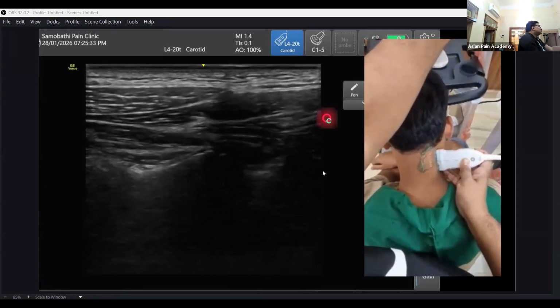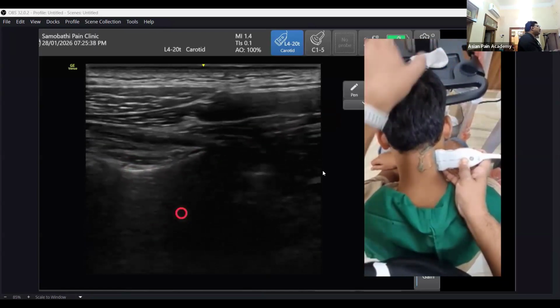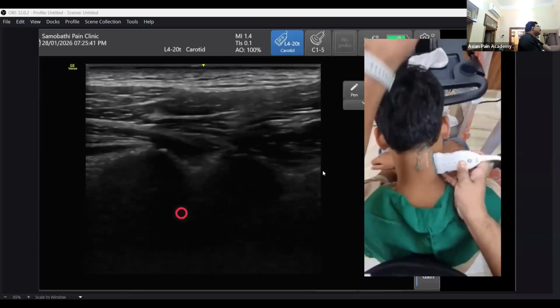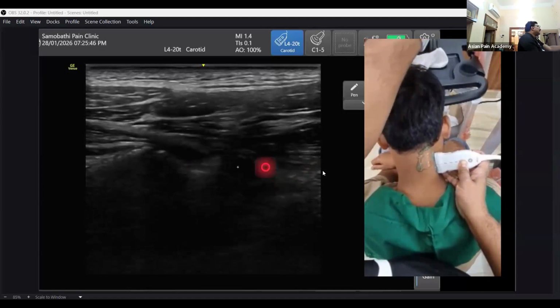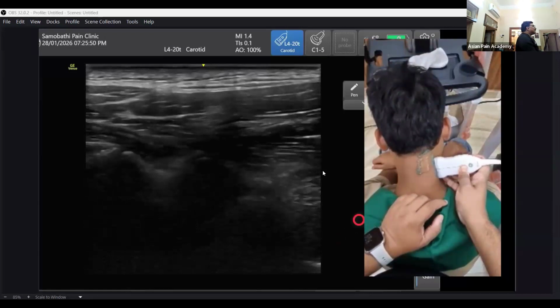Scribble. Just here you see the nerves. And if we go down again at this point, there are the nerves. Again here are the nerves. So in each undulation on the basis, we will be able to see the nerves.